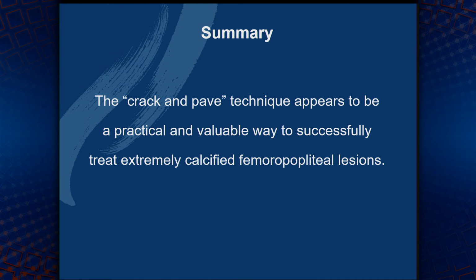So in summary, the crack and pave technique we use in Leipzig quite often appears to be a practical and valuable way to successfully treat extremely calcified femoral popliteal lesions, and therefore has become the method of choice in our hospital to recanalize heavily calcified lesions. And I think there are several more data coming soon.